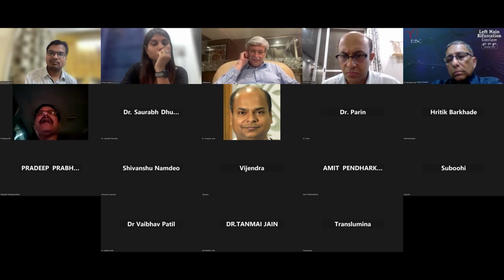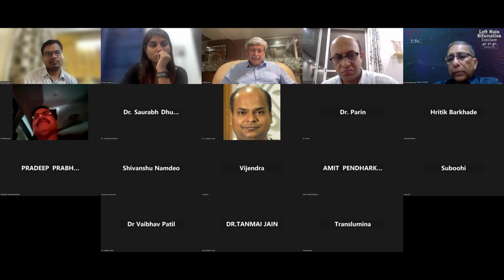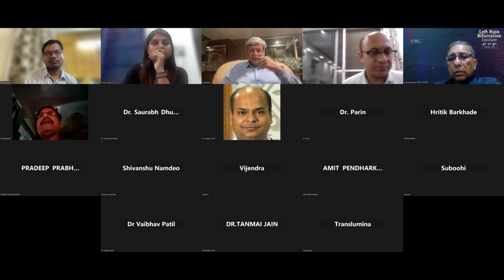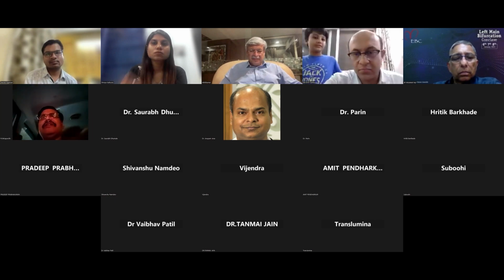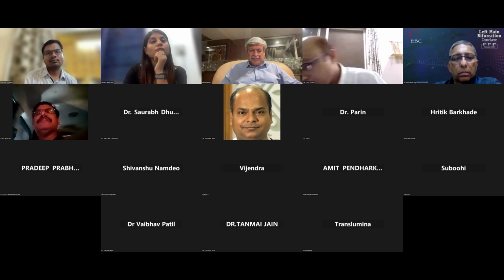And second, most important in Fielder, as Dr. Sonde aptly told, when you want to drill, it went into the hard portion and into a side branch, which is very rare for new wires, because they are very sliding wires. Because of the polymer jacket, you get the least resistance and least tactile feedback with these wires.